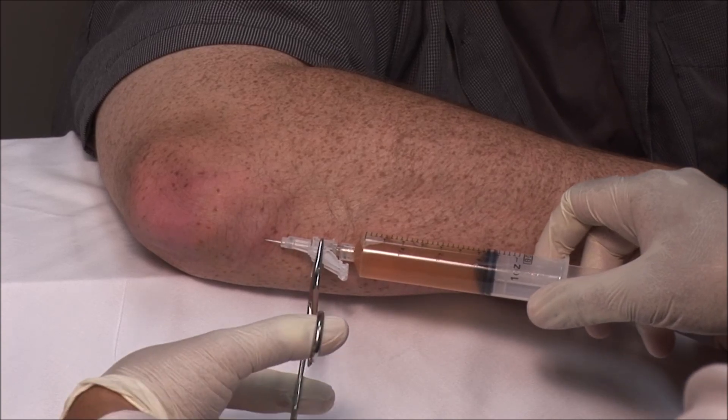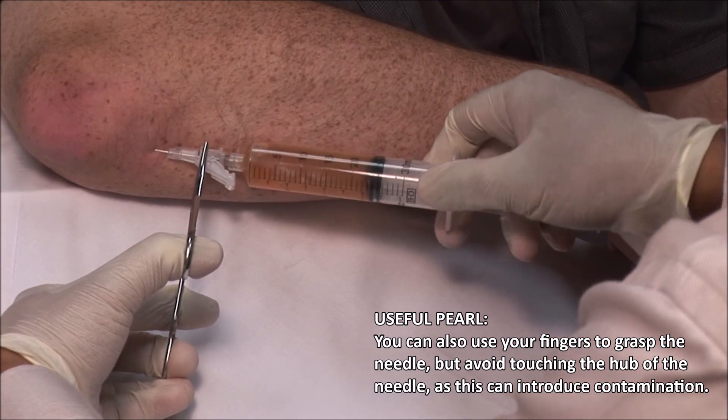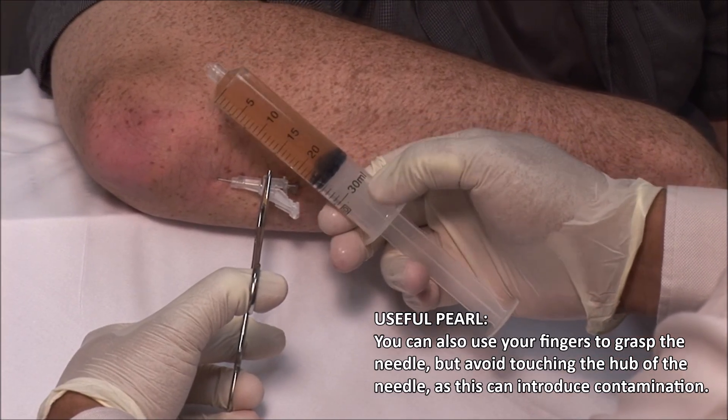Using a forceps, stabilize the needle and switch syringes. I have obtained about 24 cc's of fluid.